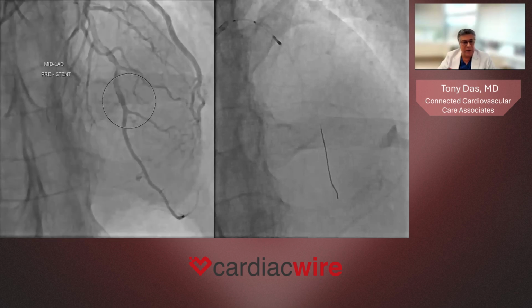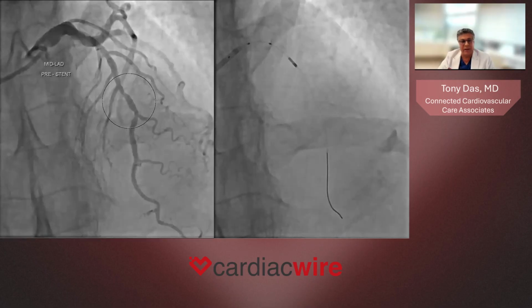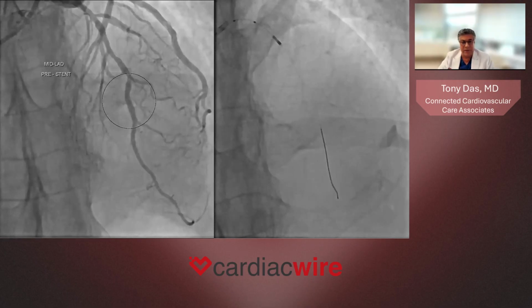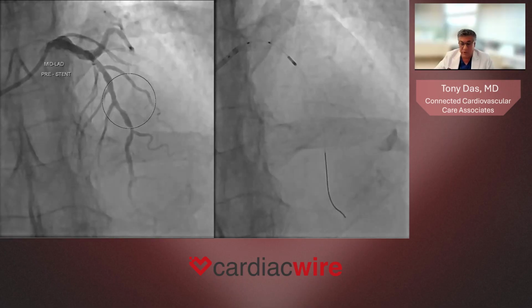And as Dr. Morales pointed out, sometimes the cath lab is the place we think is the gold standard location. As an interventional cardiologist, I'd like to believe that. But here, the lesion looked moderate, not severe, but the CT was clear, and the AI program on top of it was also clear. So intravascular ultrasound was performed, which suggested that the lesion was quite severe.